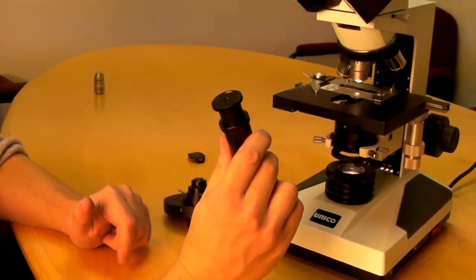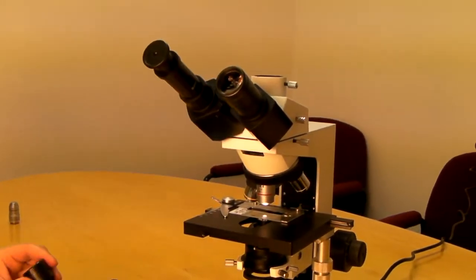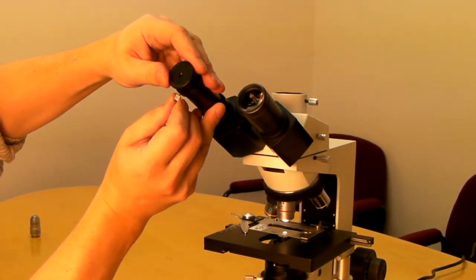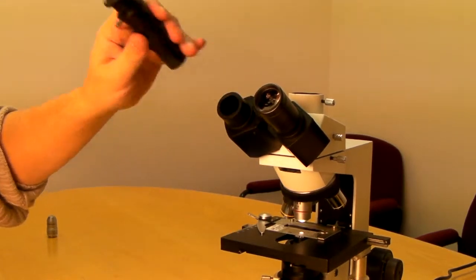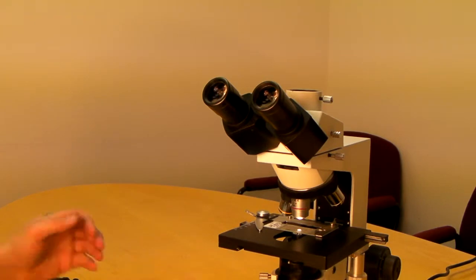And also a centering telescope. The centering telescope is installed in place of the regular eyepiece, and then by adjusting the height you can put this lens in focus as well. Now we are ready to assemble.